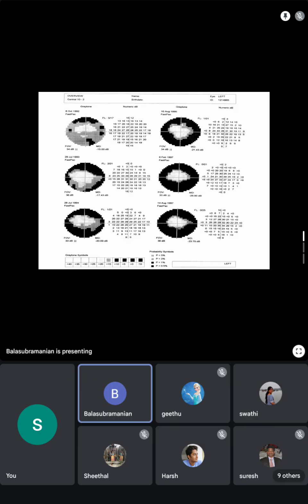Overview analysis. Yes, overview. What does the term overview mean? What are they doing here? They keep about 16 printouts of single field analysis without providing any other details. It is not statistically associated. Why are they doing this?